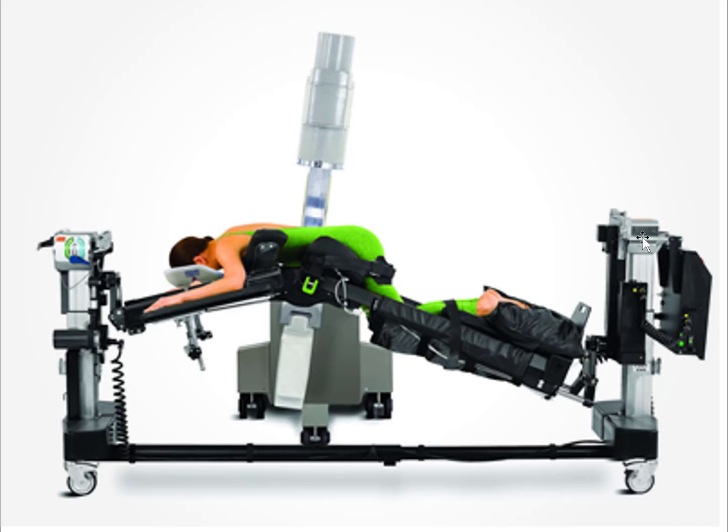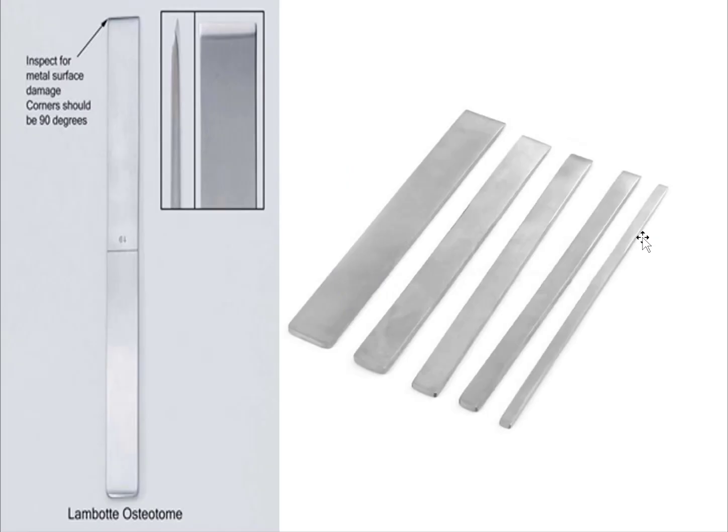Now, when you put the patient in the prone position, they're usually somewhat kyphotic, and the OSI Jackson table is very good for that. And then after the osteotomy is completely done, you reduce the deformity with the table. You can see there's an elbow right there at the level of the spine. You just ask the anesthesiologist to hit the button that makes it straight, and you have to show the anesthesiologist, because during the procedure you're tired and the anesthesiologist is going to forget.